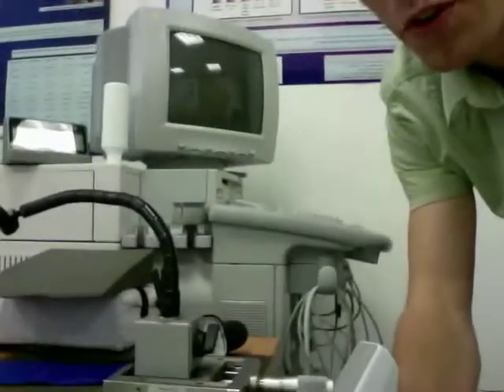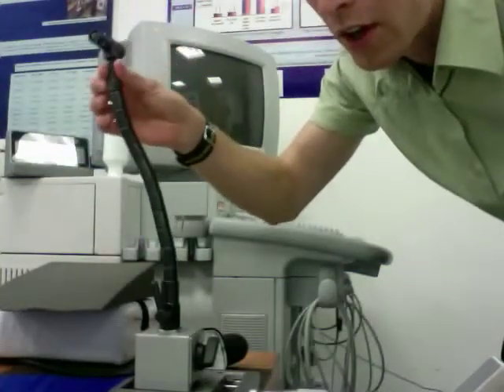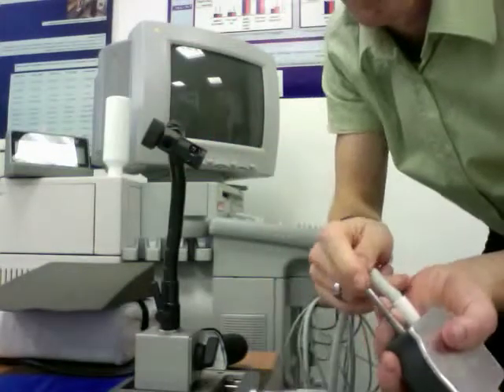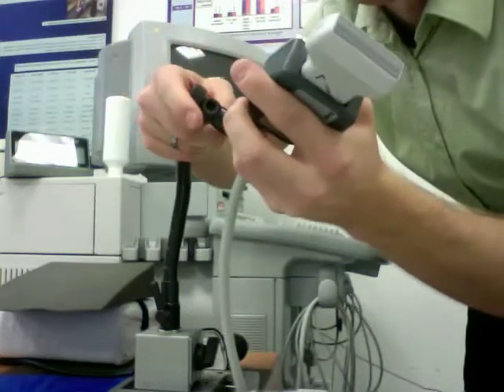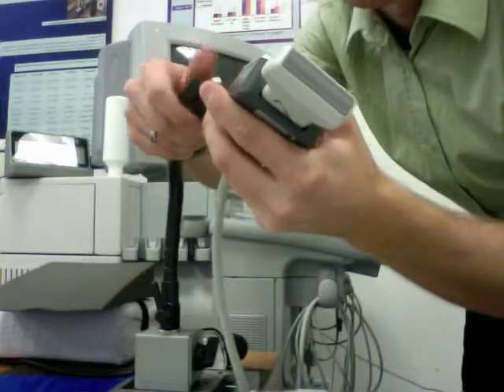Our probe holder is here. You saw it — it gives you an idea of the size. Basically, the probe, a little barrel, fits right into this part here. It just unscrews, slides in, and then can be tightened.